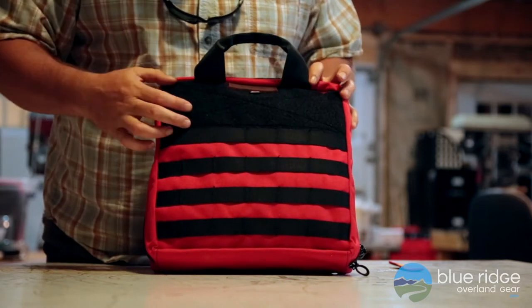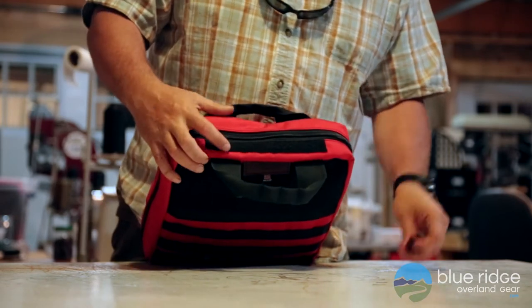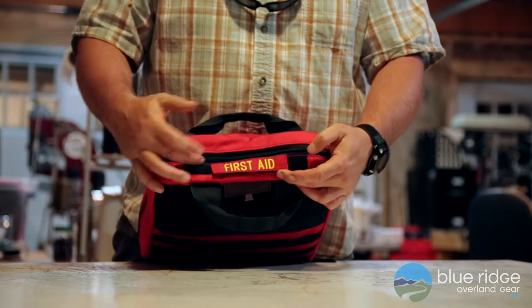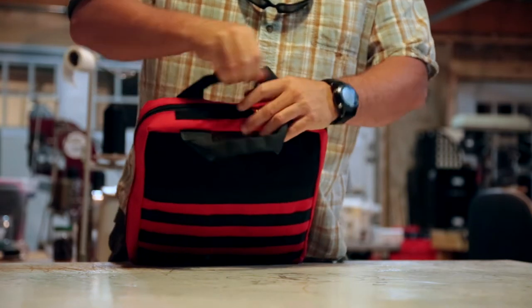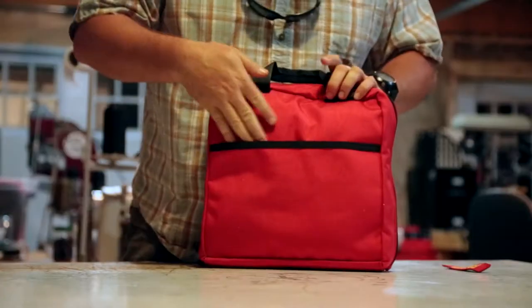It's got a four-inch section of velcro across the top so you can add velcro pouches to it. On the top there's also a section of velcro so you can add a name placard to it. It has two handles to carry it.